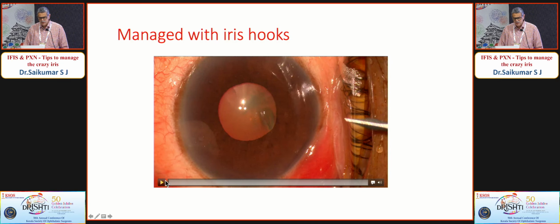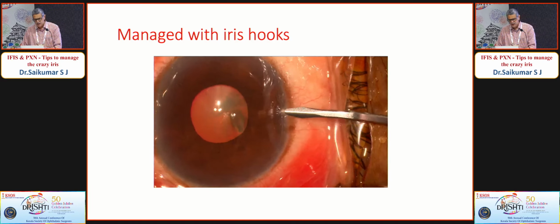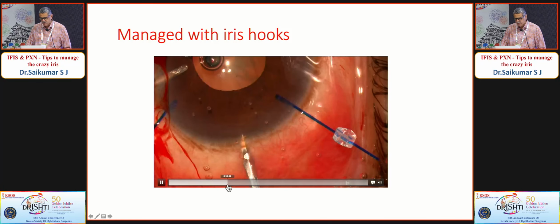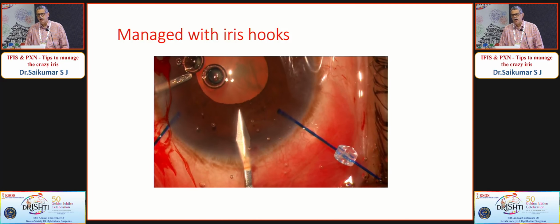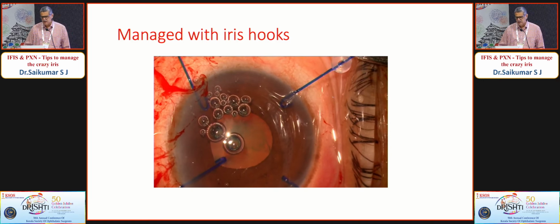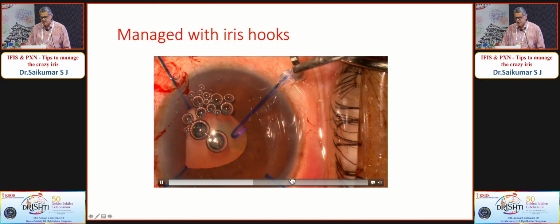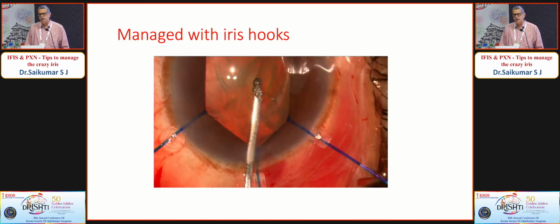This was a case which was managed by iris hooks. This was a slightly older video. This particular case probably I would have used a B-hex if I do it now. I usually use, for IFIS, 5 hooks. So use a paracentesis just before, underneath your main wound in a different track, and through that your 5th hook goes in. So you have something like a pentagonal iris that is available for you, and this is how the iris looks like once you place the 5 hooks.